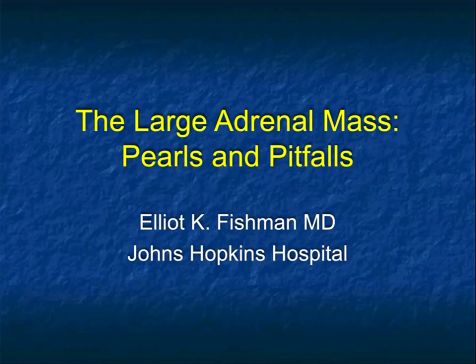During the past few months at our weekly case conference, I've been showing a lot of adrenal cases that have been larger masses, and you recognize how difficult it is to make the diagnosis prospectively. There are lots of things that overlap, and there are challenges, but there are also certain pearls that really help you reach the right diagnosis. So what I'm going to do in this set of lectures is look at the large adrenal mass and work with you to figure out how good we are at making the right diagnosis.